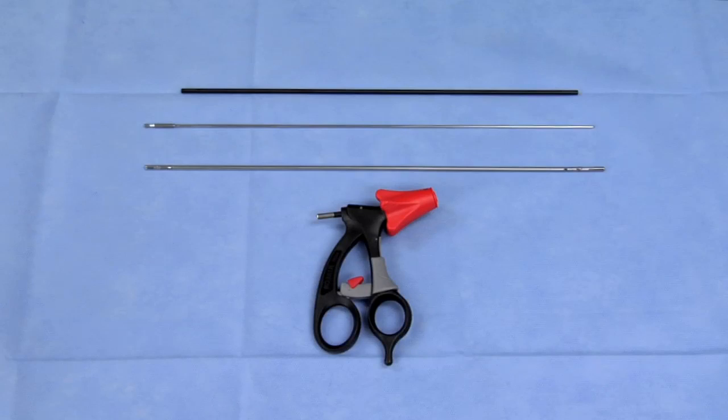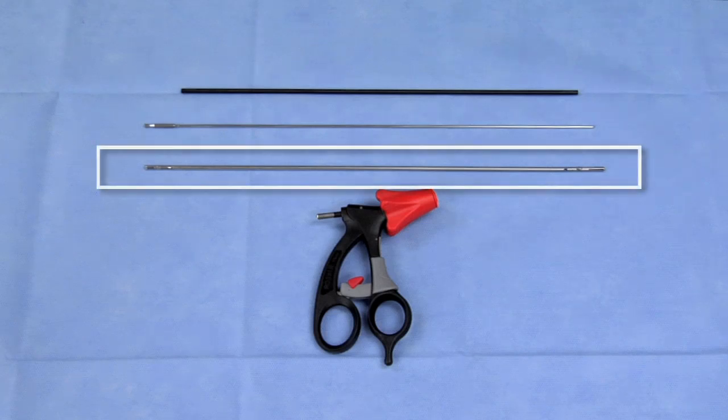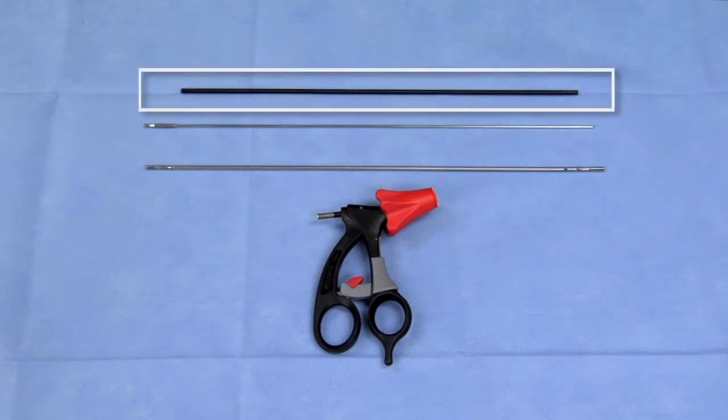Esculap Sovereign Mini 3.5 millimeter laparoscopic instruments are comprised of the following components: handle with toggle switch, rotation knob, and movable handle component, jaw insert, push rod, and outer insulation tube.